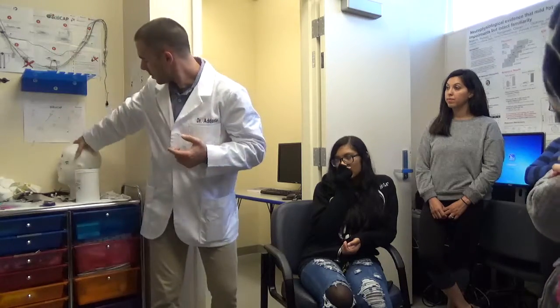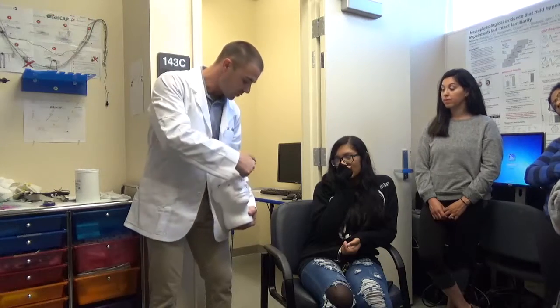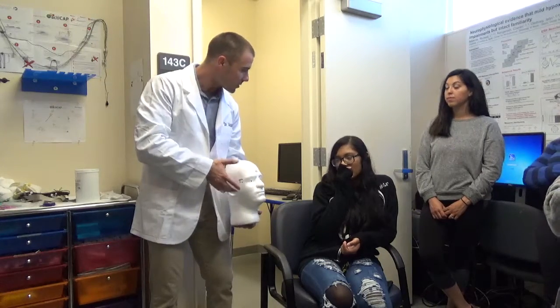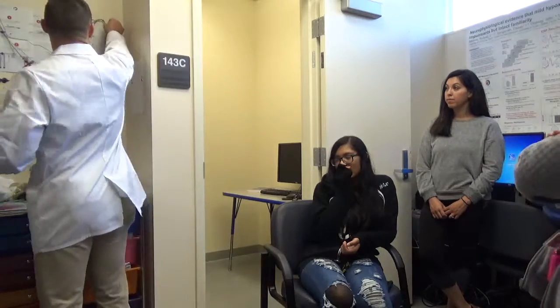scientifically is we have ways that we can do algorithms that subtract those blinks from the brain activity. But in order to subtract that information from the brain activity, we need to know what to subtract. Well, we need to know what the blinks are. So what we do is we also record the actual eye activity from electrodes that we put, as we saw in this gentleman, above and below the eye, and also to the left and to the right. So this is just, again, a non-invasive measure, and we show them that it's just one of these.